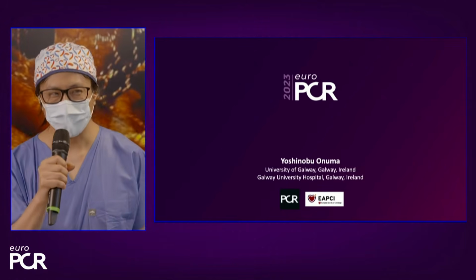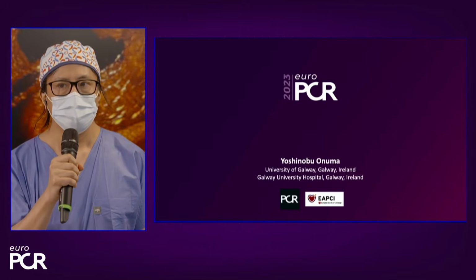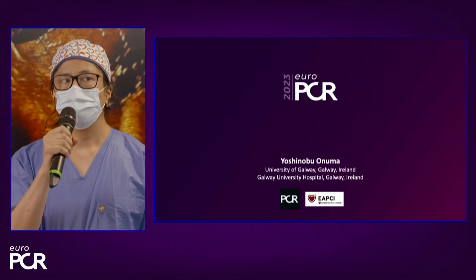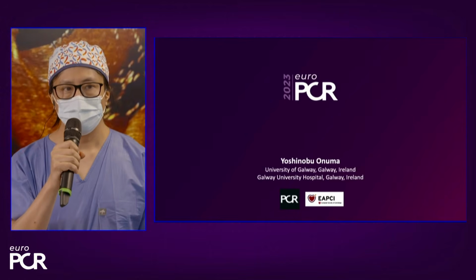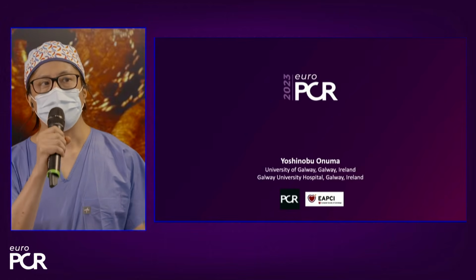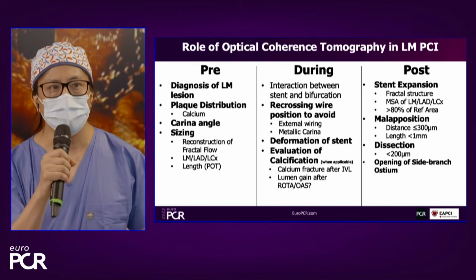So we've seen beautifully from you the benefits of OCT and OFDI in the initial assessment for morphology and then in the optimization. Do you want to take us through where you see the role of imaging in this type of complex intervention? Yeah, thank you, Tom. Maybe can you advance slides next, please?